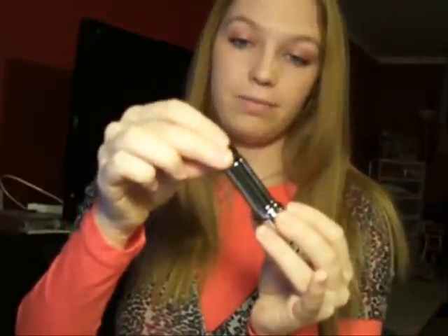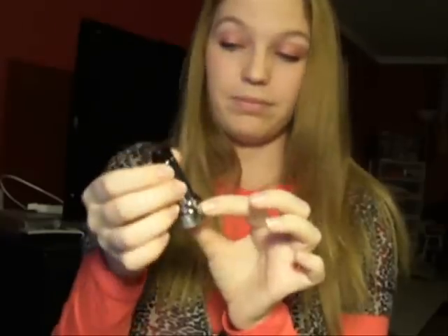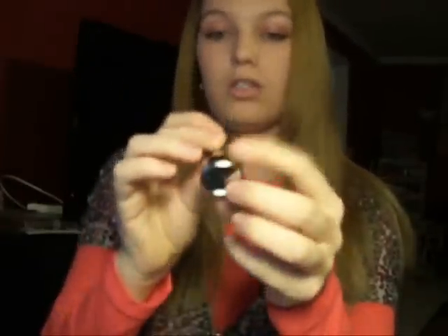Then you put it back on after it's dried, and you look through it. It's like a little microscope. And then this down here is a button that you push to turn on the light inside so that you can see what's going on. So you push the button, you look to see, and this also spins back and forth so you can focus it. It does say to do it in the morning because eating foods and stuff can affect the result.